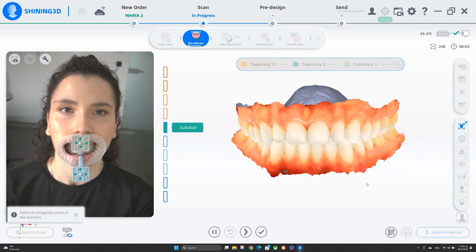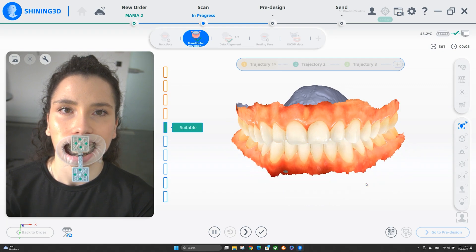In the first module we can see all the movements: protrusion, lateral protrusion left and right, open and close, and free movement. We also have the optimal jaw relation, where we calculate and evaluate the freeway space.